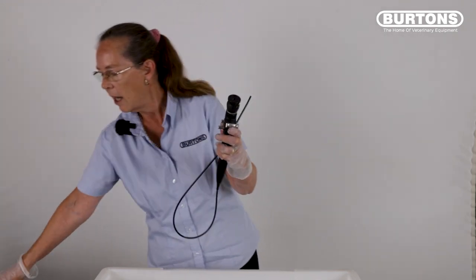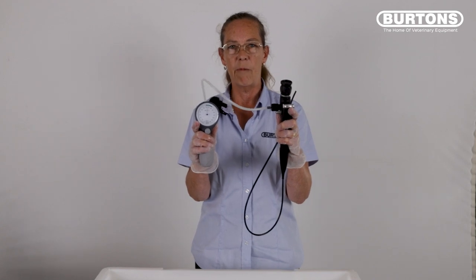Connect the leak tester to the endoscope and perform a leak test before you immerse the scope. Make sure the needle is set at zero and inflate to approximately 12 o'clock, which is in between 140 and 160 mm of mercury, or the green safe zone.